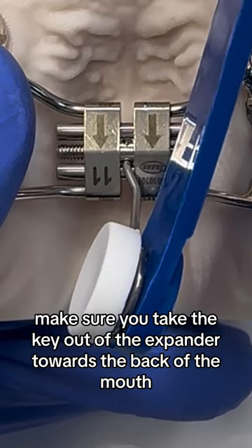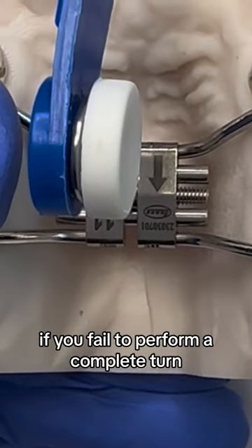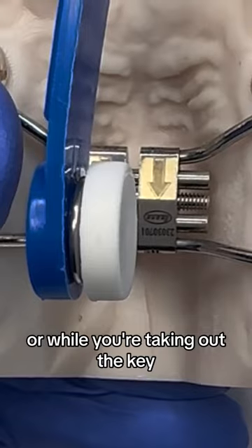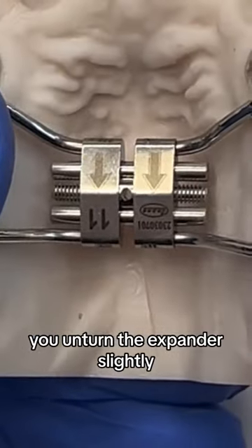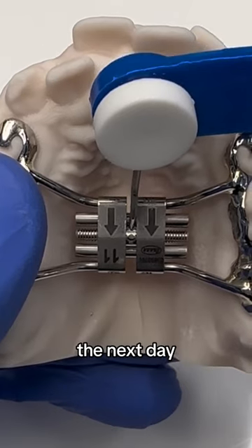Make sure you take the key out of the expander towards the back of the mouth. If you fail to perform a complete turn, or while you're taking out the key you unturn the expander slightly, you'll be left with a situation where you're unable to find the hole the next day.